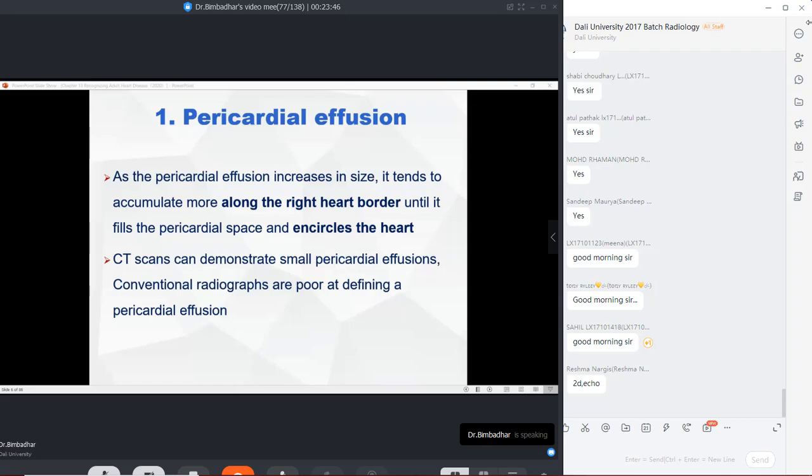But since it is like digital photography that everybody is able to appreciate, even by looking at a simple CT scan, an undergraduate with no information will be able to get an instinctive feeling that something is wrong around the pericardial area, right? Yes, 2D echo is also one of the good modalities to be done, but the gold standard we will be considering for pericardial effusion is CT.